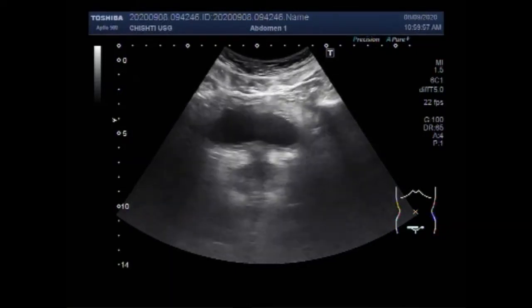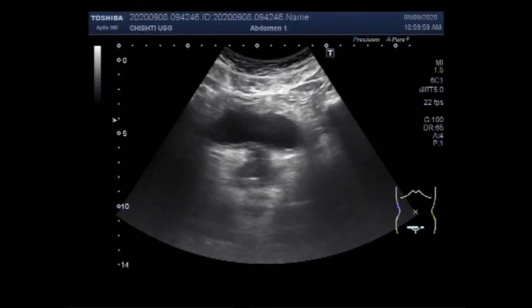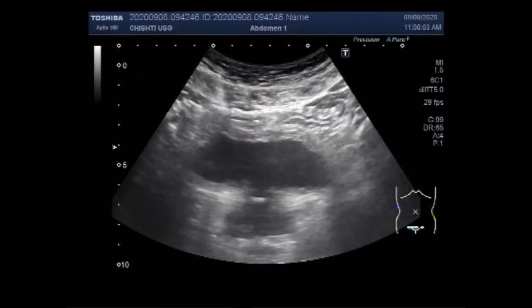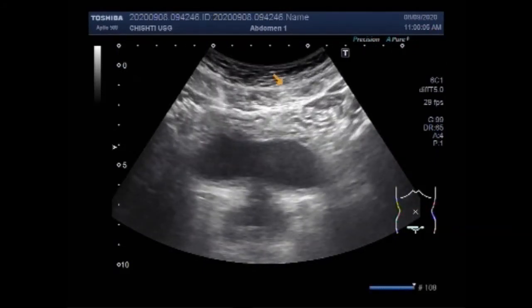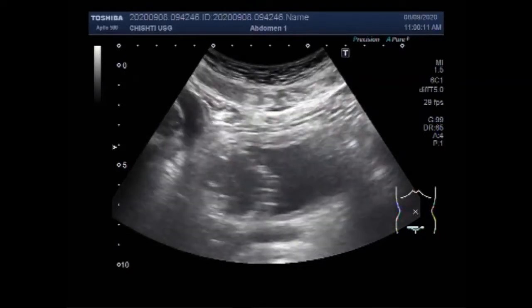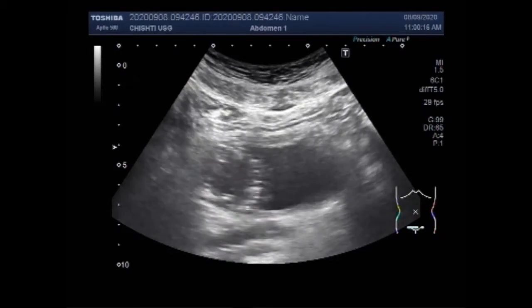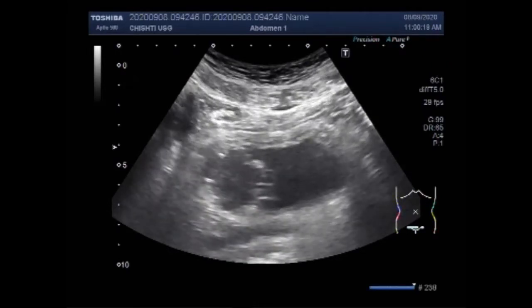Dear viewers, I hope you are all fine. This ultrasound video shows a large mosaic growth, and incidentally this patient also has multiple stones in the gallbladder. You can see the urinary bladder, and a mass is seen along the left lateral wall of the urinary bladder, close to the base of the bladder.